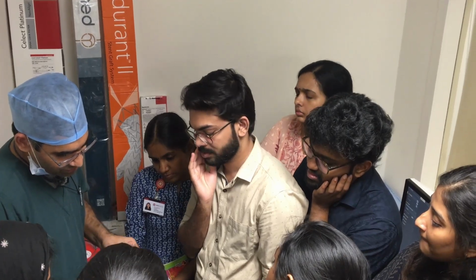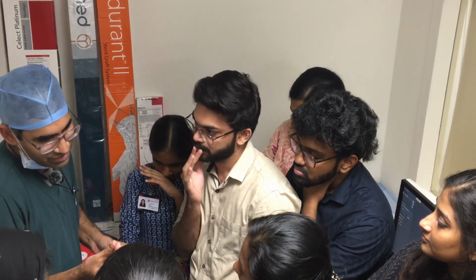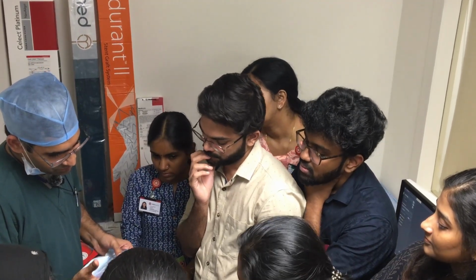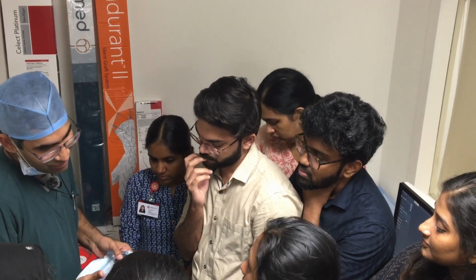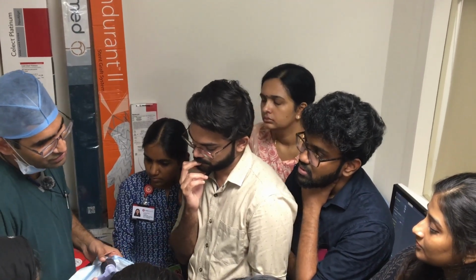Inflation devices also come in various sizes depending on the balloon. Smaller balloons require very little volume. If you use a larger balloon, it will require large volumes, so you need a syringe which can have large volume. Typically, we fill only 50% or 30% of the syringe.